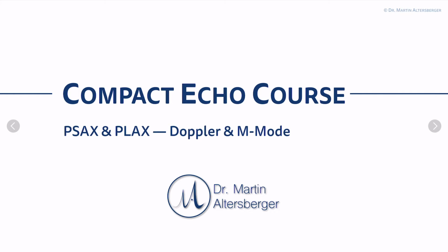Continuing with the compact echo course, we will discuss the peristernal short and also, to a certain degree, the peristernal long axis view, how to use Doppler, for example pulsed wave or continuous wave Doppler, and certain M-mode measurements we already started to talk about in the prior video.